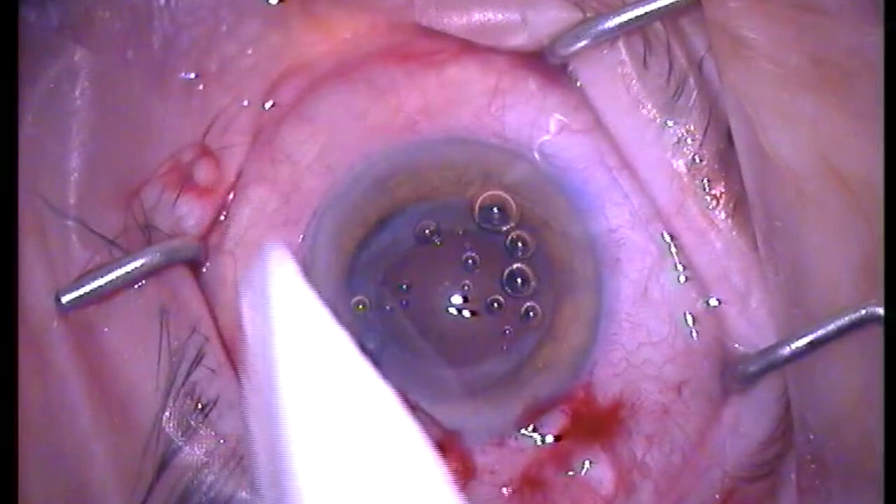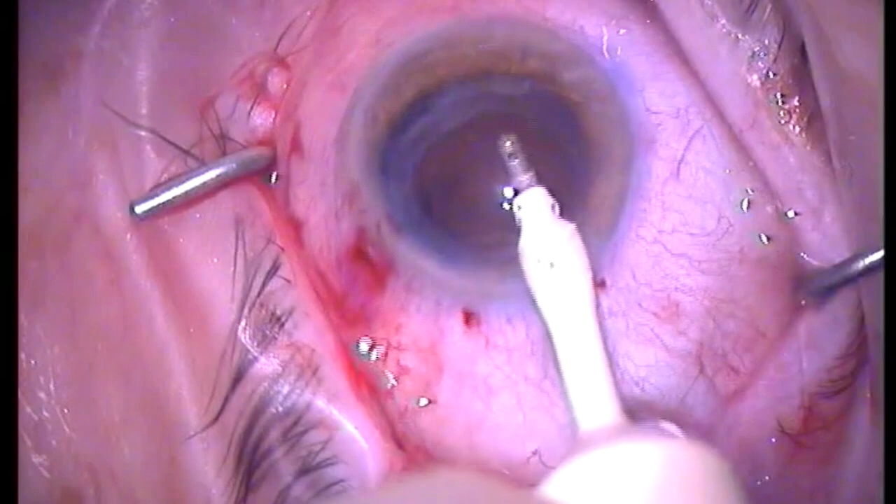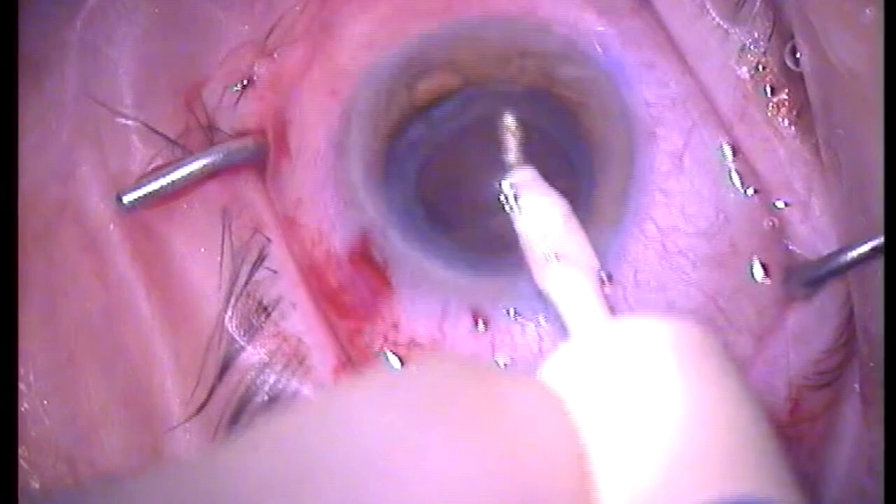This patient was referred to me from a colleague, having undergone a primary multifocal lens implantation for cataract surgery 11 months prior to her consultation. She had an unaided vision of 6/10 with N10 near, correcting with a plus 1 minus 1 to 6/6.